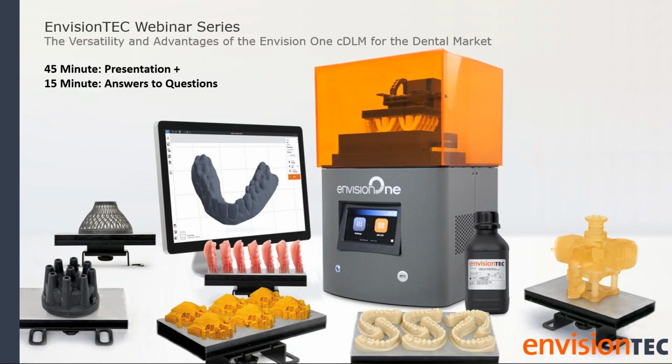There's also another method that I've seen labs use where they lay the models out on a paper towel with a desk fan, and you walk away again. It completely dries off the alcohol. You come back and put it into your post-cure unit. If you have an auto flash, 250 flashes for E-model light, a couple of times. It takes less than a couple of minutes, really, with the auto flash.